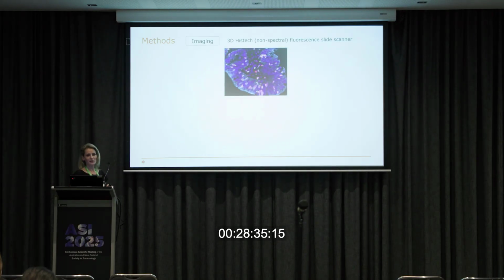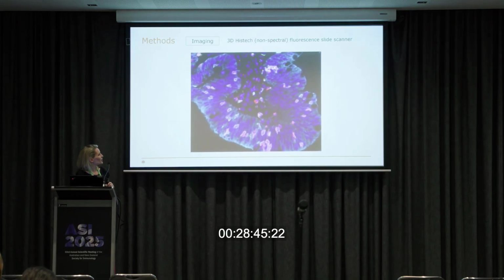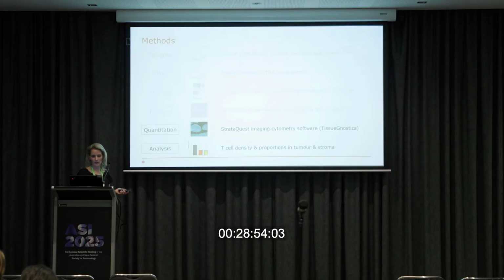And so we end up with this pretty thing that unfortunately is cancer. So people who come in often will see my screens go, wow, that looks really cool. Yeah, it's cancer. So very pretty, but we don't want it. But this is what we ended up with. So we've got our tumour infiltrating lymphocytes here, and we've also got some of the stromal T cells.